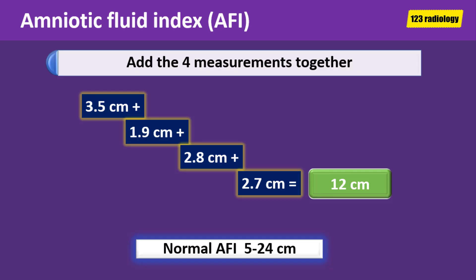As you can see in this case, the amniotic fluid index is about 12 centimeters, which is within normal values. A normal amniotic fluid index measures between 5 to 24 centimeters.